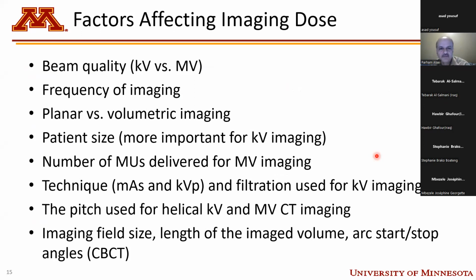So what affects the imaging dose? There's a whole list of items. The beam quality, kilovoltage versus megavoltage. The frequency of imaging. Whether we do planar, meaning 2D imaging, or volumetric, 3D imaging. Patient size matters, as you'll see later on, and is more important for kilovoltage imaging.